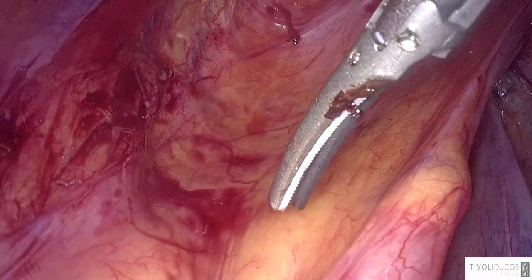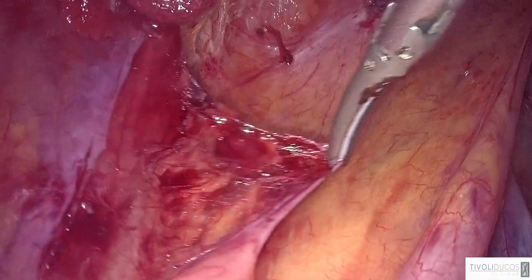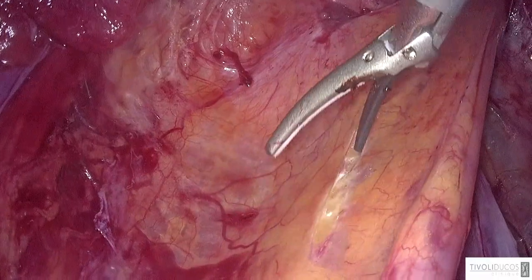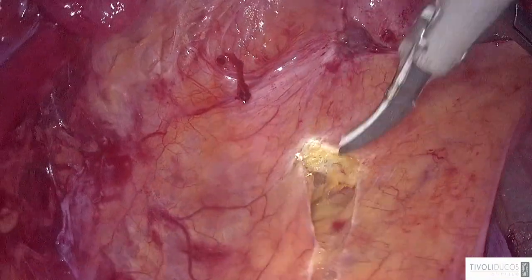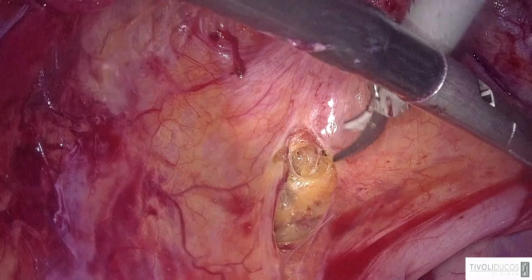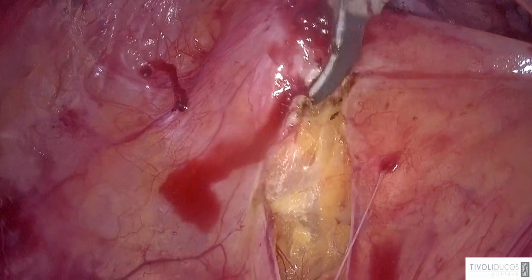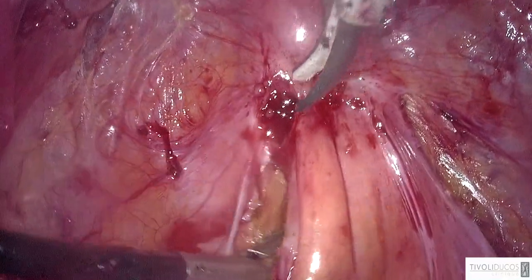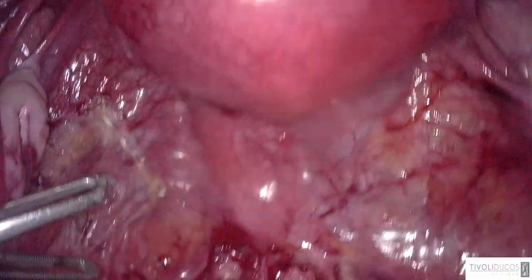Now, I told you that I want to carry out a disc excision, so I will take the peritoneum from here, and I will incise it along to the rectal wall, and I will take a contact with the rectal wall at the rectovaginal space in order to be able to clean the rectal wall and to make it suitable for a disc excision. So last year I did a disc excision like this. So the procedure is somehow similar, and we are carrying out in our department 100 rectal disc excisions a year. Yes, clean, slowly. Okay, very well.